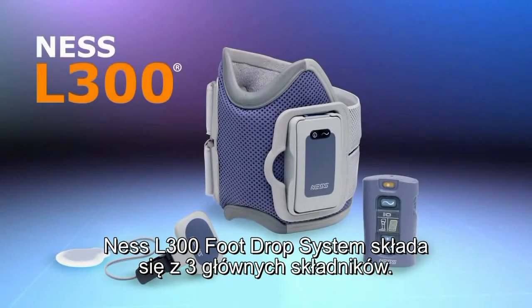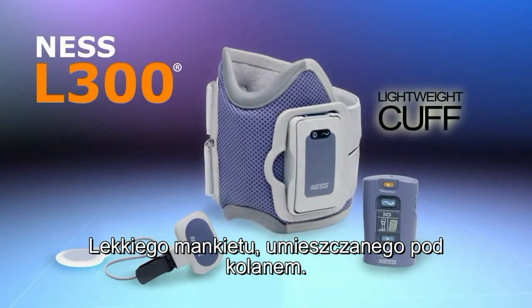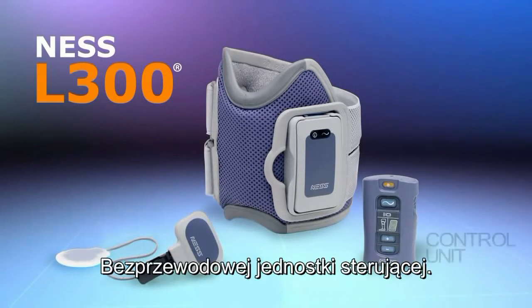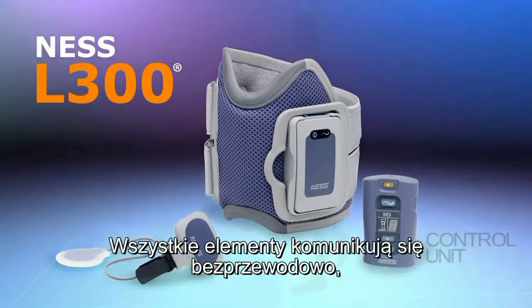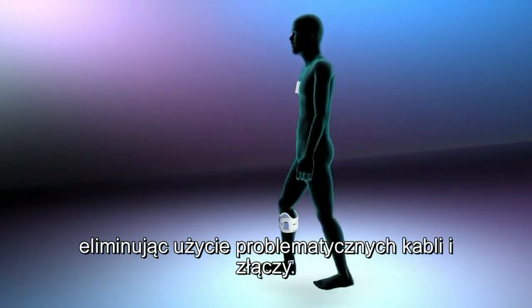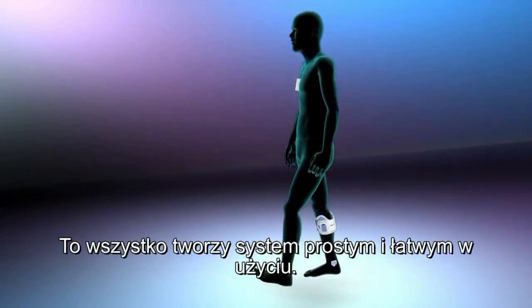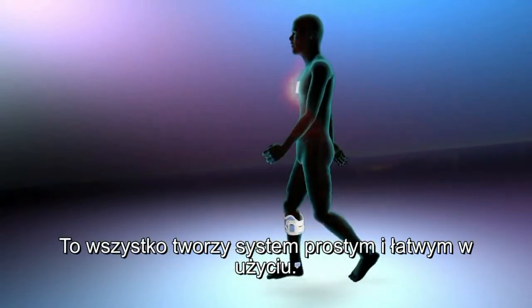The Ness L300 foot drop system consists of three main components: a lightweight cuff that fits below the knee, a small gait sensor placed in the shoe, and a wireless control unit. All three communicate wirelessly, eliminating the need for troublesome externally worn wires and connectors, making the system simple and easy to use.